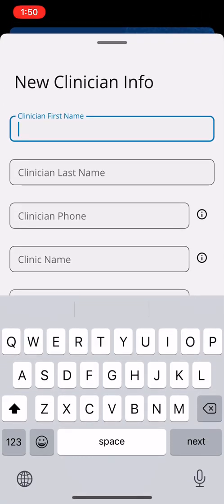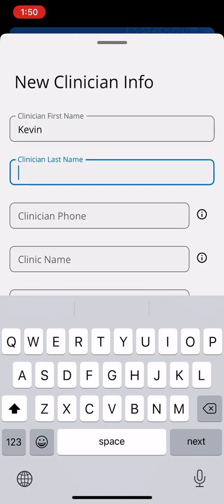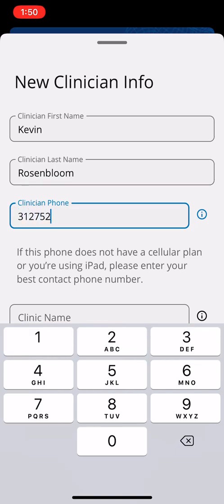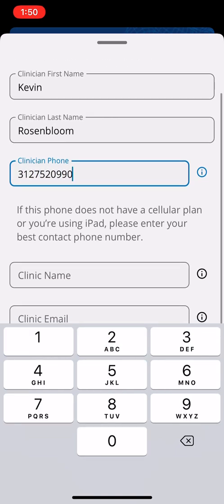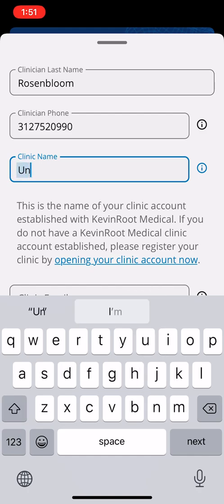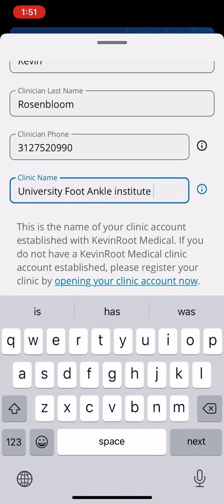Let me go ahead and add the clinician. I'm going to put myself as the clinician — my last name, my phone number. If you're using the iPad, go ahead and put your business phone number in the clinic name. Right now I'm at University Foot and Ankle Institute, in Santa Monica, where I see patients part-time.